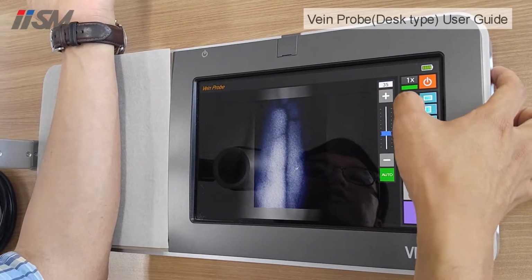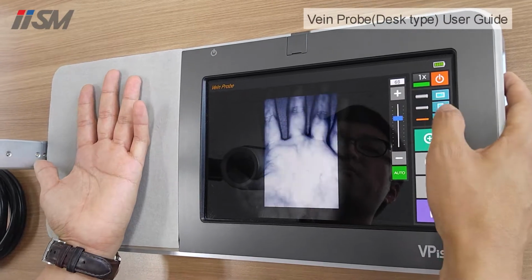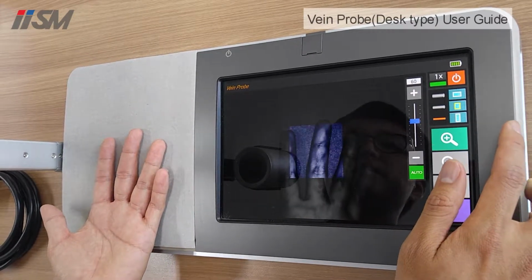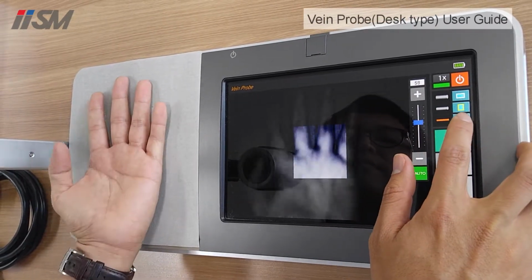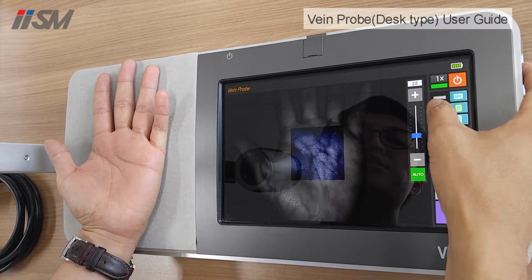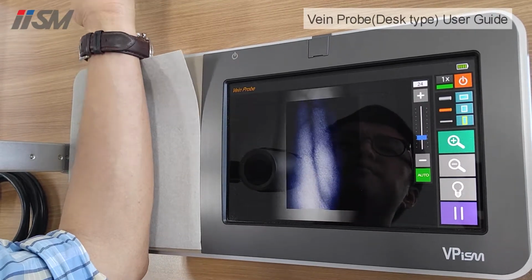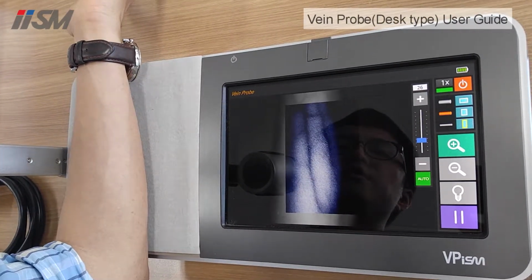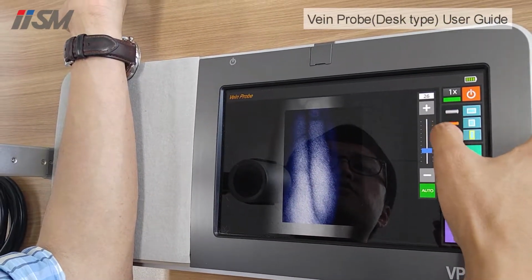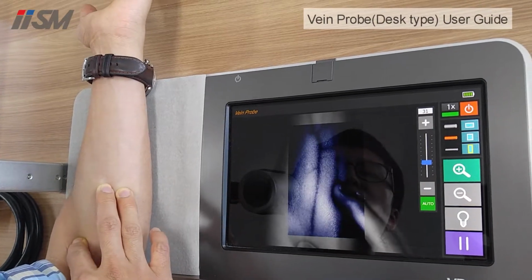Okay, and then here you can also see the thickness of the vein you are interested in. For example, in the hand, you would be more interested in the thin capillary vein, so a smaller region of interest. And then you see there, you see the capillary vein there. You can see the vein here. Like that. If you want to see the normal vein for IV injection and for phlebotomy, you use this region here at the bottom, and this one here for the normal size blood vessel, to see the vein.